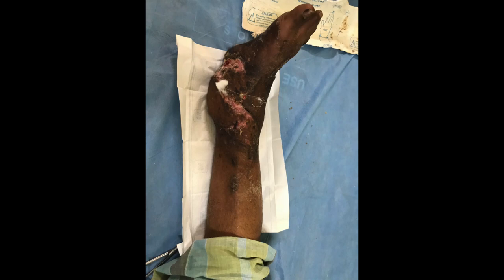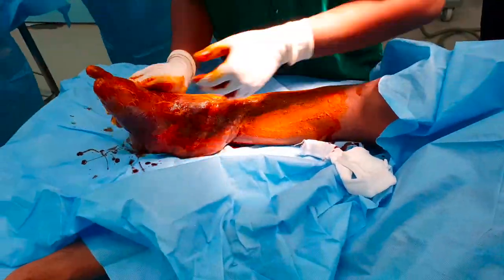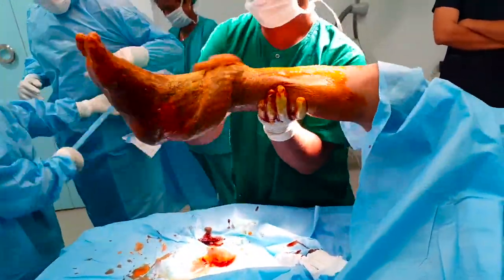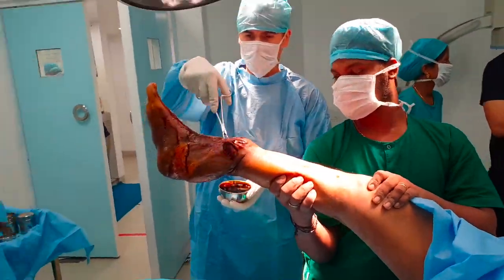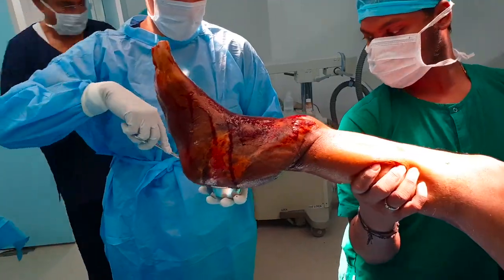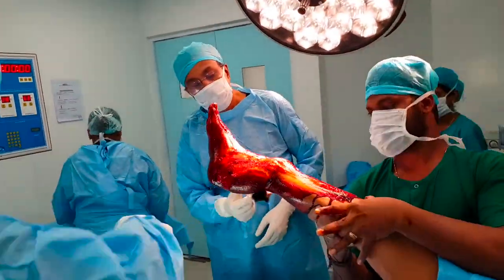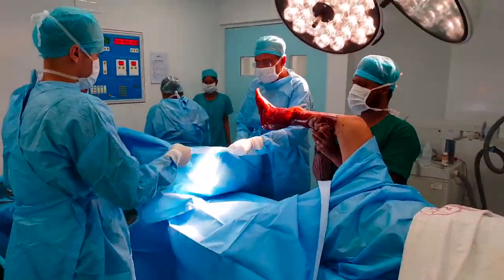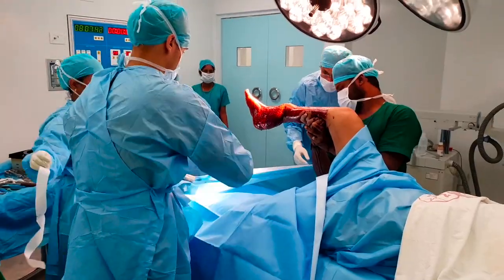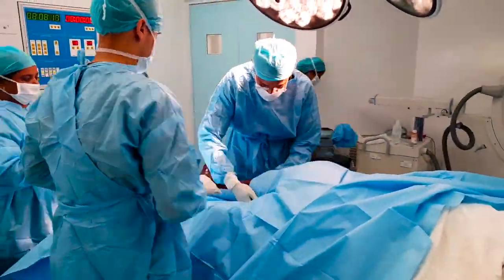The surgery is performed under spinal anesthesia. When the limb is inspected, it is flailed and deformed though functional and vascular distally. A pre-scrub is given where the leg is cleaned with povidone-iodine solution. It is then prepared and draped in standard manner as for any orthopedic surgery. The toes are left free and it is ensured that the foot is fully visible as we intend to apply a metatarsal ring. A standard set of disposable tibial drapes is used.